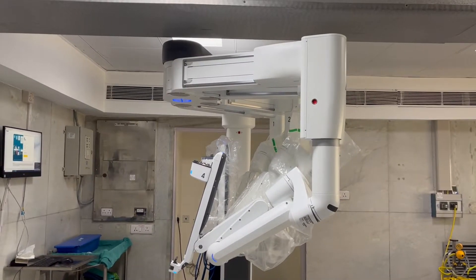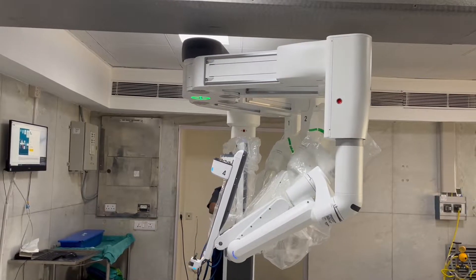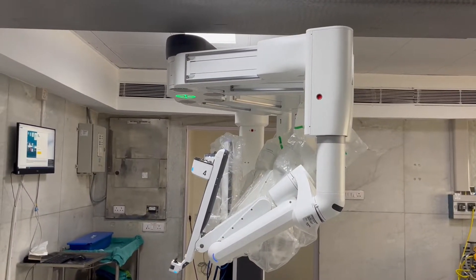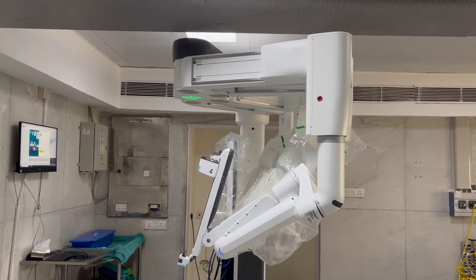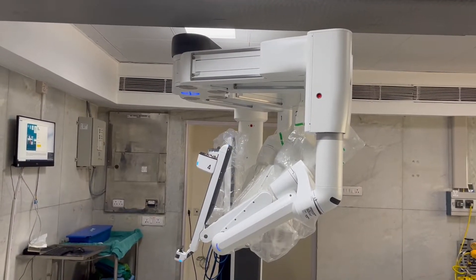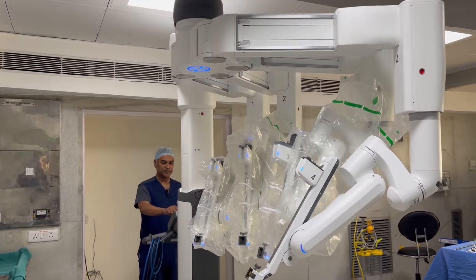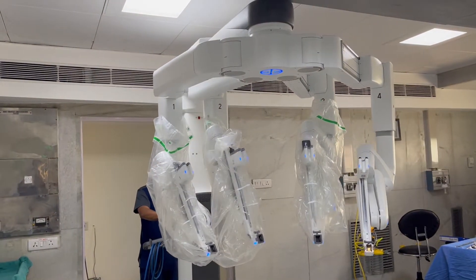I can move this to various sides — for example, I can move this backward or forward, to this side or that side. These are the various side movements, and when the surgery finishes I can go back to the original position. This is the deploying of the robot. When surgery is finished, we go to store, which means we go back to the original position.